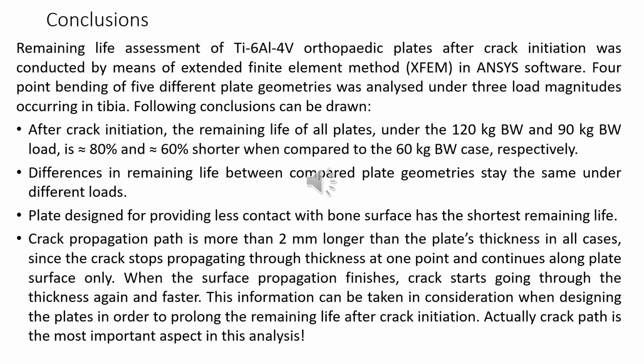So what we want to emphasize at the end of this presentation is the fact that the crack propagation path is the most important aspect in this analysis. We can see that more than 2 mm longer than the plate's thickness is something specific for all cases, because a crack stops propagating through thickness at one point and continues along the plate surface.